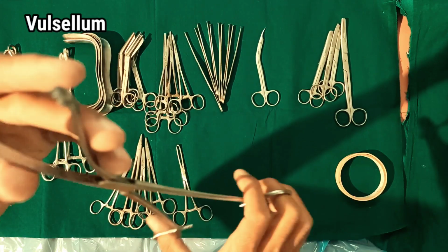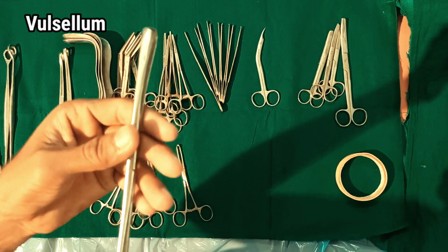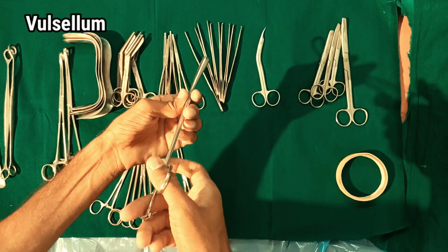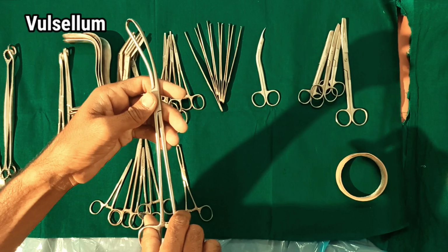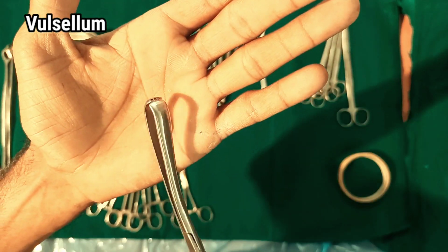Vulsellum forceps are used to grab the cervix or uterus during procedures such as episiotomy, hysterectomy, or dilatation and curettage. Vulsellum forceps have hooks at the tip of each blade and are often used in obstetric and gynecological procedures.